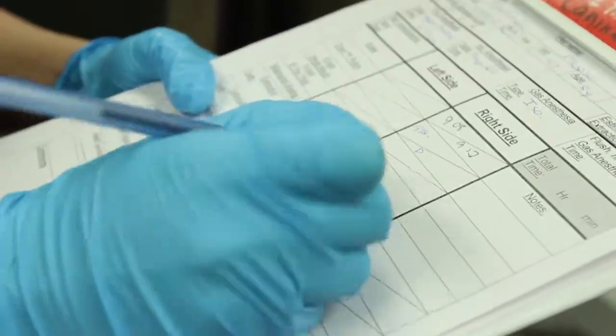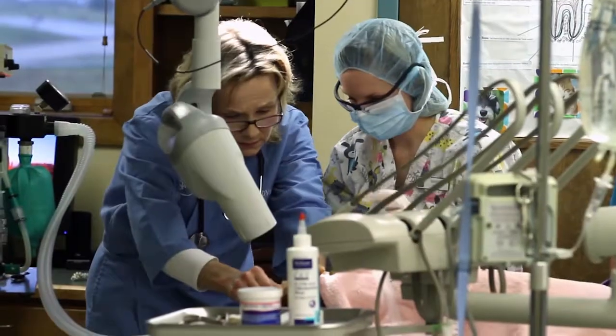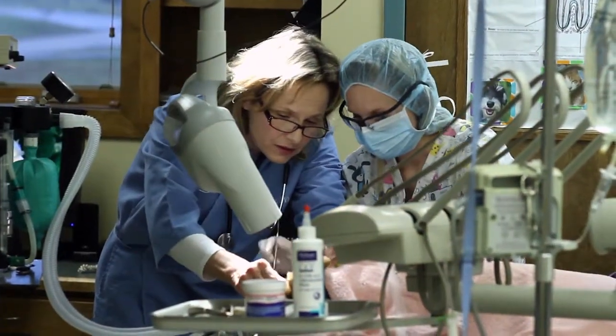They're going to hand you as the veterinarian the dental chart and the radiographs. You're going to diagnose and treat. But the technicians never leave our side because we're pretty helpless without them.